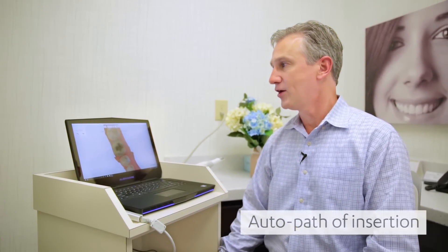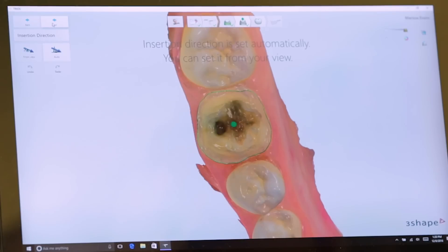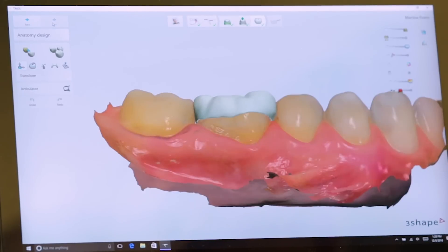Now we'll go to our next step, which is setting the direction for our path of insertion. That is also done automatically. If you want to make changes in the path of insertion, that can be done as well. Now we'll go through our initial design.